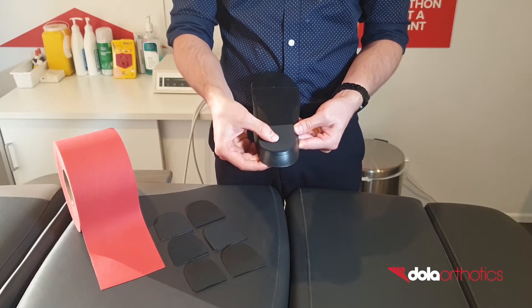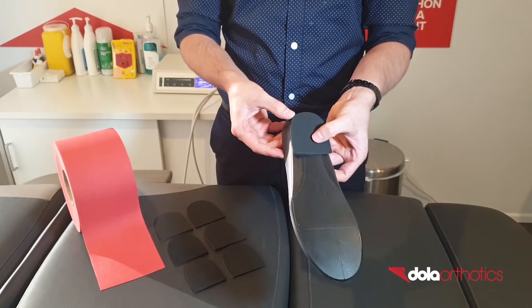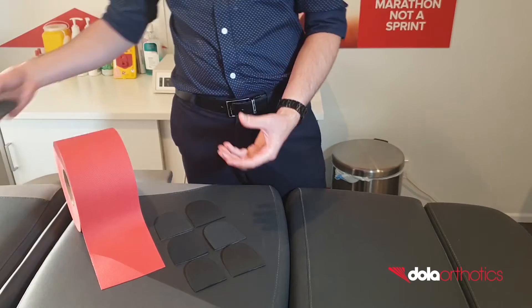This modification can be used to increase rear foot valgus control or increase the orthotic reaction force lateral to the subtalar joint axis.